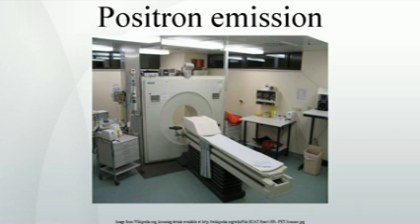PET scanning does this using radiolabeled molecular probes that have different rates of uptake depending on the type and function of tissue involved. Changing of regional blood flow in various anatomic structures, as a measure of the injected positron emitter, can be visualized and relatively quantified with a PET scan.